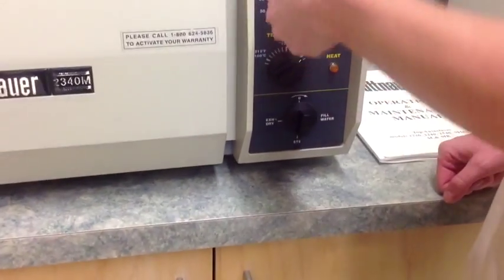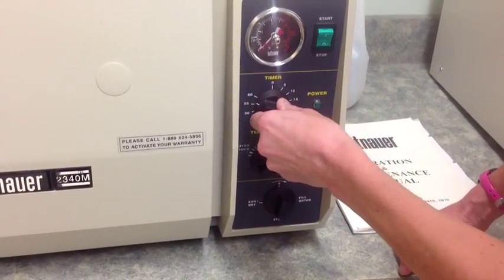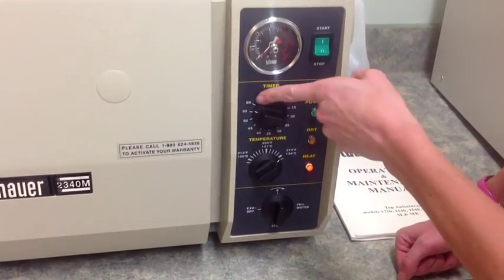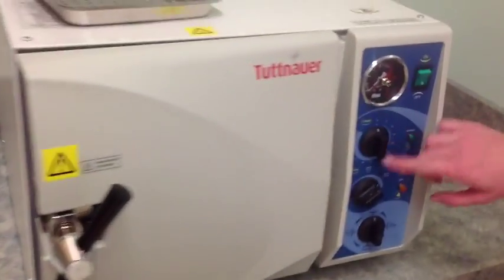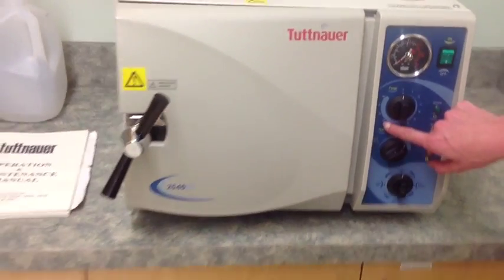Now you can turn the multipurpose valve to the sterilize position. Set the timer for 55 minutes and turn it on. On the newer autoclaves, you only need to set the timer to 45 minutes.